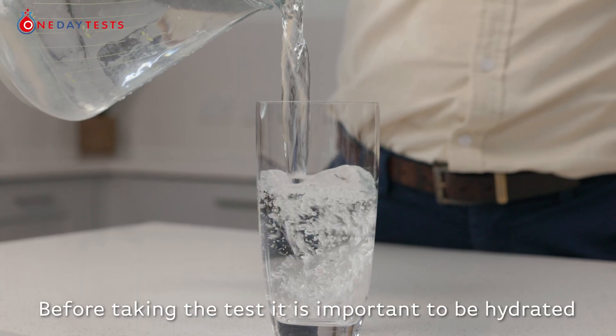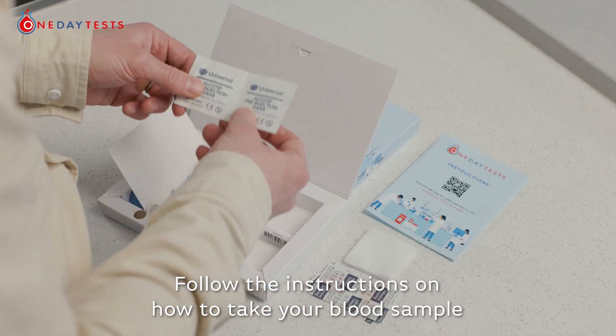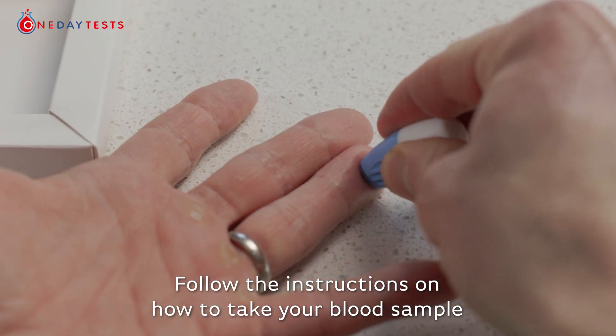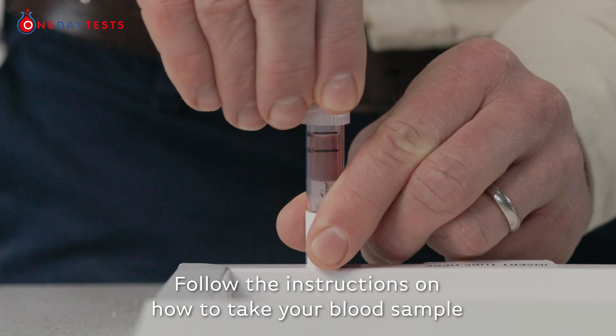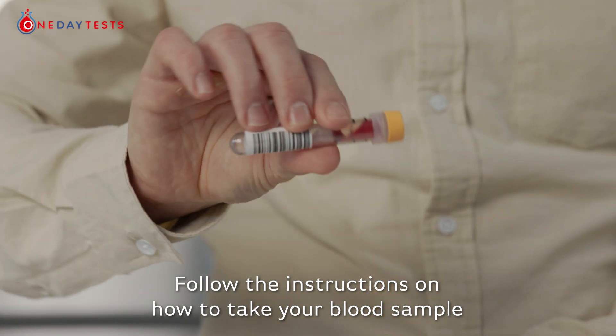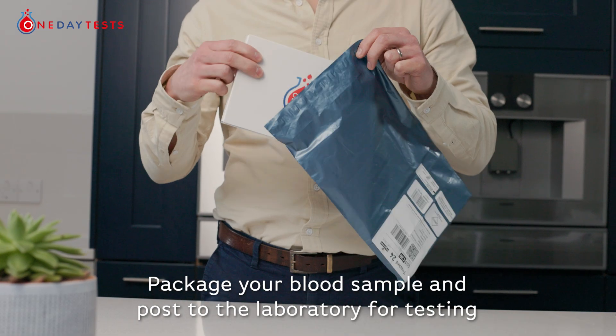Before taking the test, it is important to be hydrated. Follow the instructions on how to take your blood sample. Package your blood sample and post to the laboratory for testing.